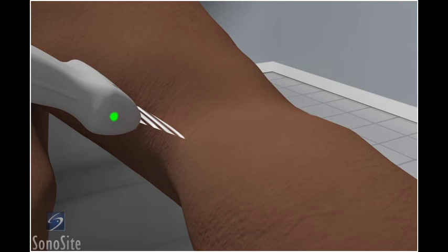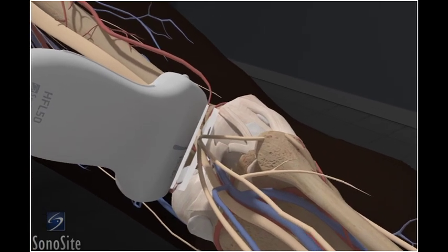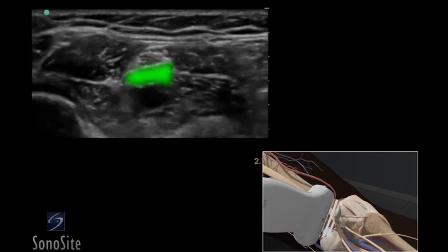The transducer is placed transversely on the popliteal skin crease with the orientation marker directed laterally. The transducer should be moved medially and laterally to identify the dark round pulsatile popliteal artery. The compressible popliteal vein can be seen superior to the popliteal artery.